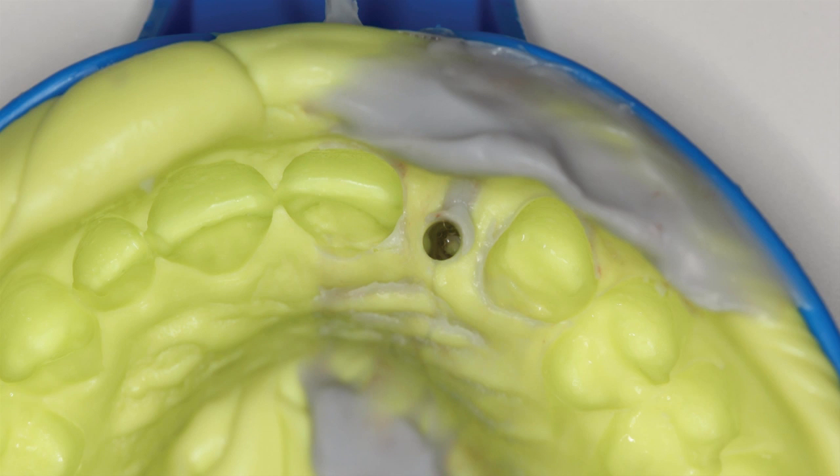In order to achieve symmetrical aesthetics and occlusion when the patient is only missing one maxillary lateral incisor, the dimensions of the restoration should be primarily dictated by those of the contralateral tooth. Thus, the lab aimed to mimic the shape and contours of this contralateral incisor.